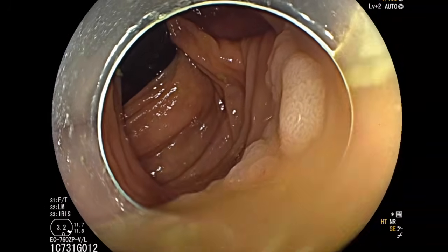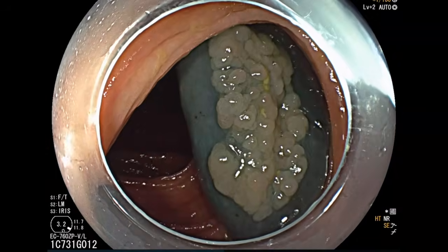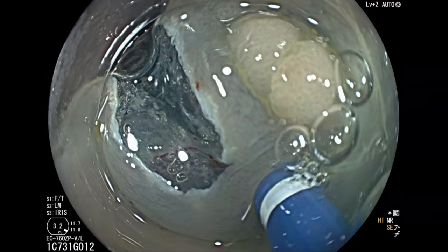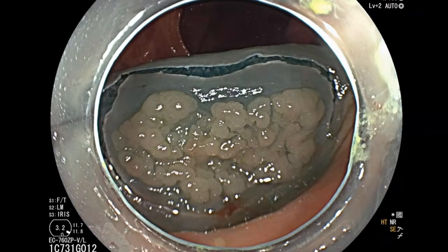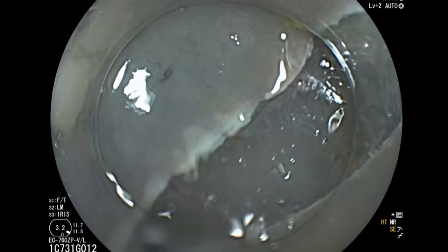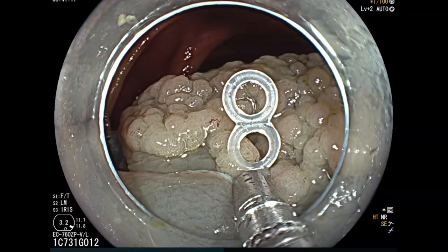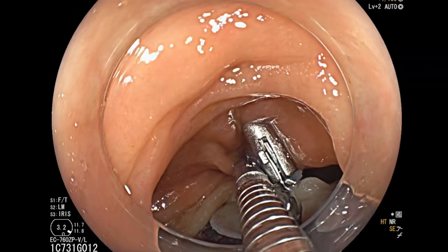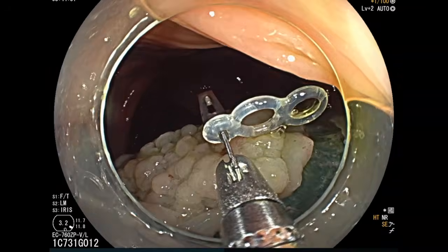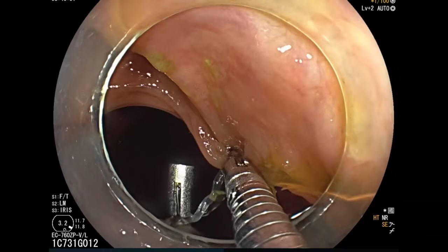The lesion was examined carefully, with limited access on retroflexion view. Therefore, we proceeded with circumferential injection and incision. The lesion was completely perpendicular to the scope, and the muscle was immediately seen on the submucosal dissection plane, which increases risk of muscle injury. We then placed 2 rubber band tractions on the anal side of the lesion, strategically choosing the point by which, after applying the traction, this would allow us to access the submucosa.